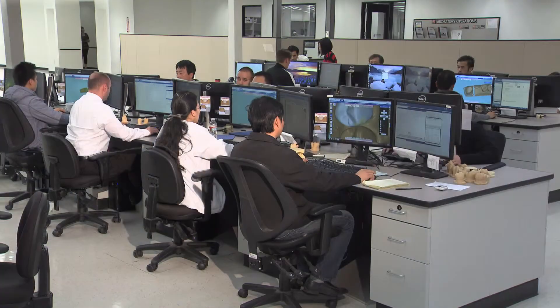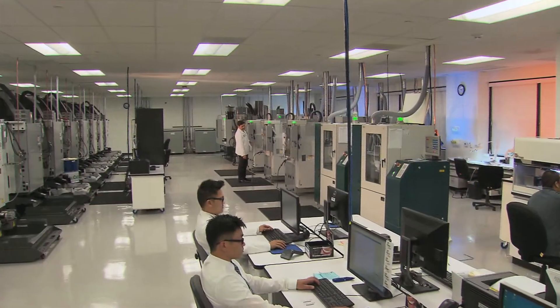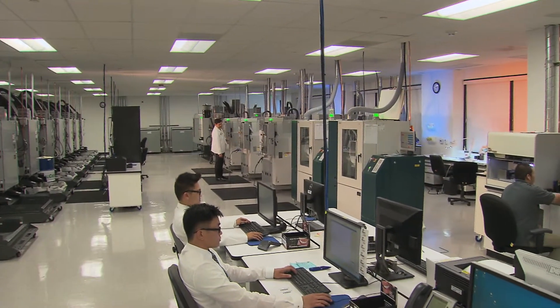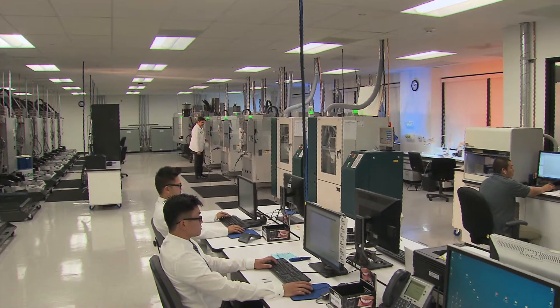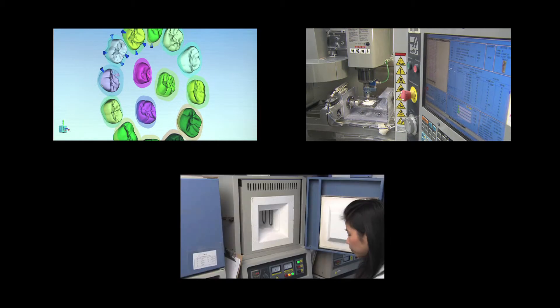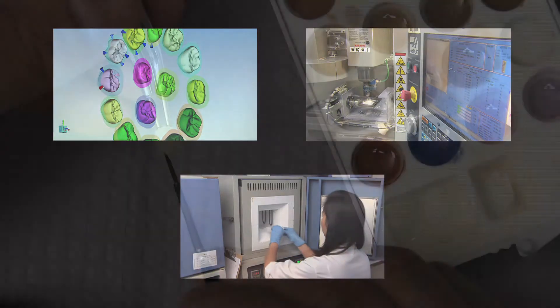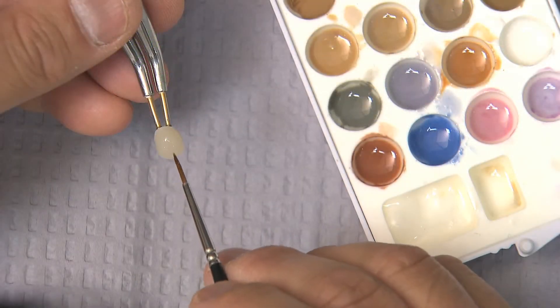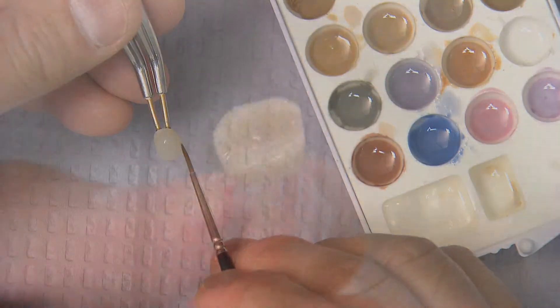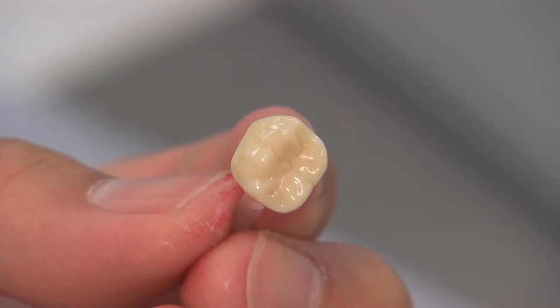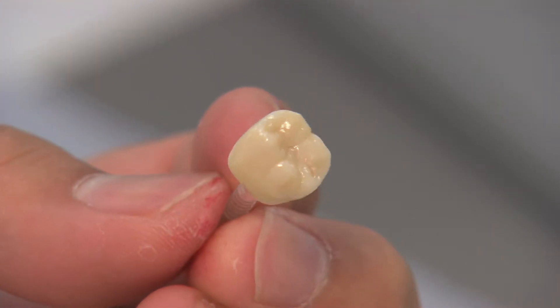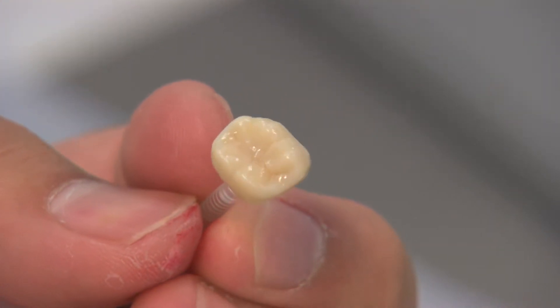Once introduced into the laboratory workflow, standard fabrication procedures begin. These include nesting, milling, and sintering. The prosthesis is then stained, glazed, and finished according to the prescribing clinician's instructions.